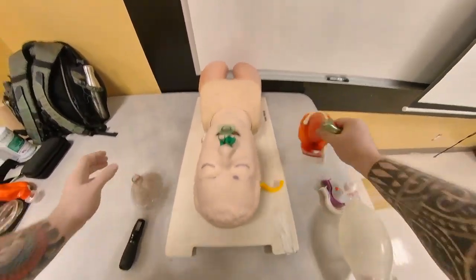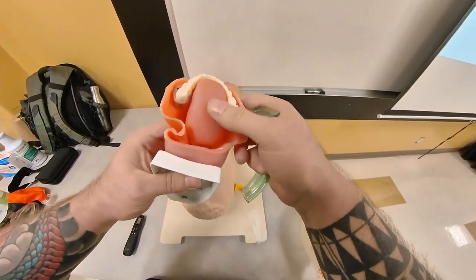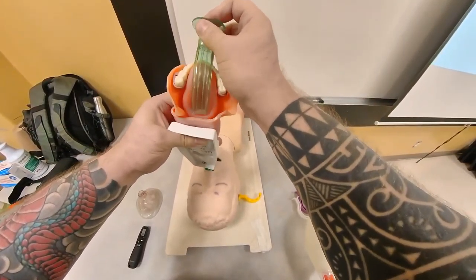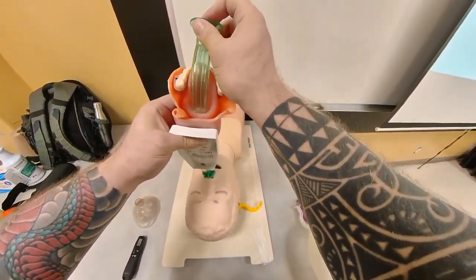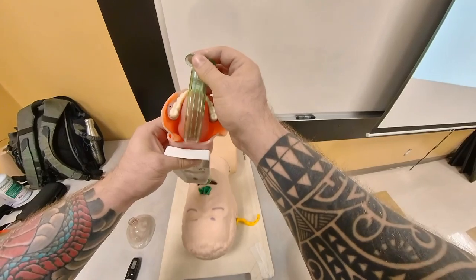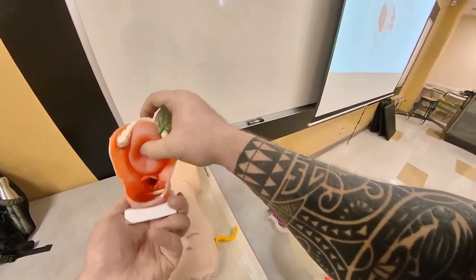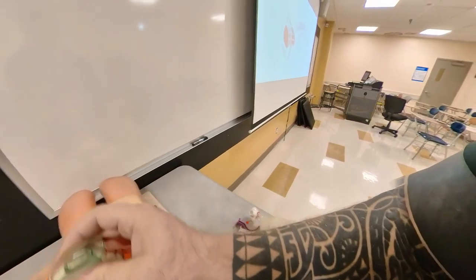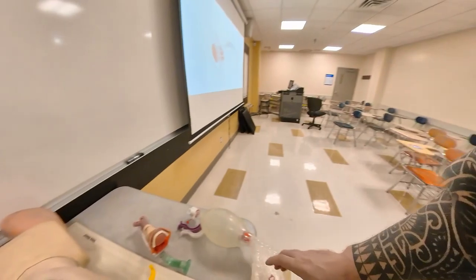Just to show you how this will look: if the tongue has fallen back, even if you put the OPA in, there is no way this OPA is moving the tongue forward, as you can see. The only motion I can perform to move this tongue out of the airway or laryngeal inlet is to use the triple airway maneuver to move the jaw upwards. Once I move the jaw upwards and move the genioglossus muscle along with it, then I have the ability to ventilate the patient. This device, the OPA, is to prevent the operator from closing the mouth.